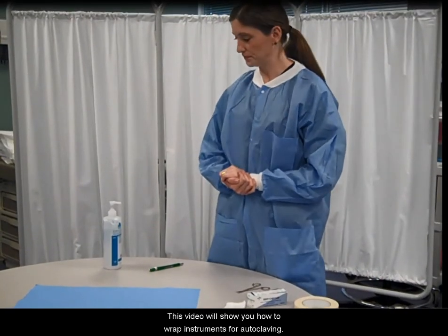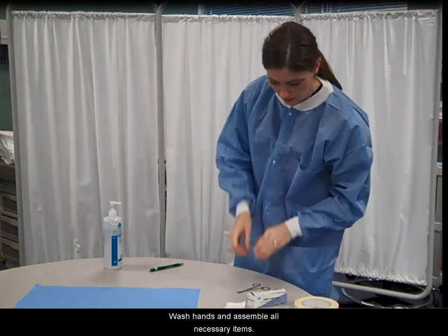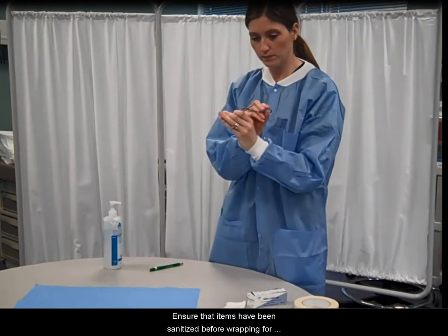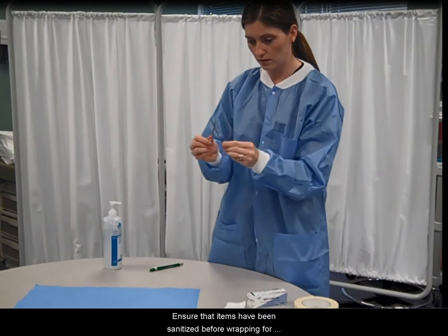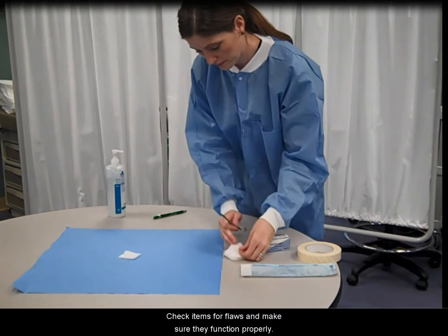This video will show you how to wrap instruments for autoclaving. Wash hands and assemble all necessary items. Ensure that items have been sanitized before wrapping for autoclave purposes. Check items for flaws and make sure they function properly.